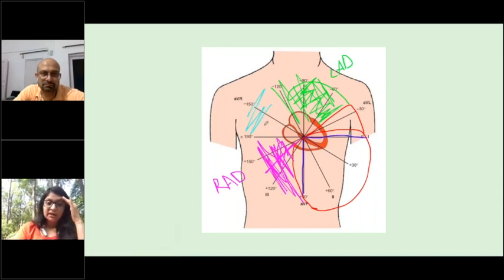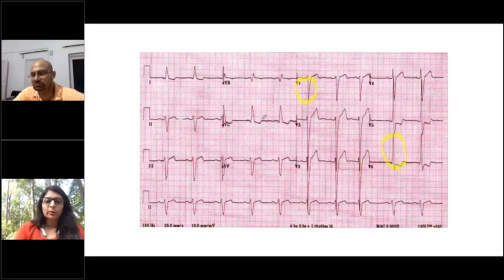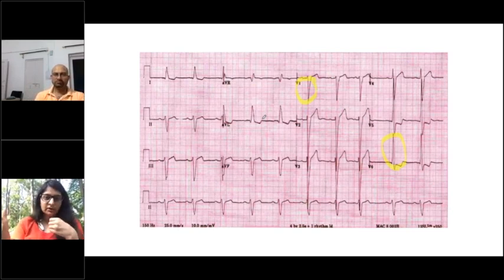So then when we look at an EKG, yeah, we'll have to pull up an EKG here actually. So let's go to this one. Yeah. So now looking at the EKG, we talked about lead 1 and lead AVF. We've already mentioned, okay, the chest leads don't make any perpendicular axis with the heart. You cannot use those to calculate an axis, okay? You can only use the limb leads to calculate an axis.